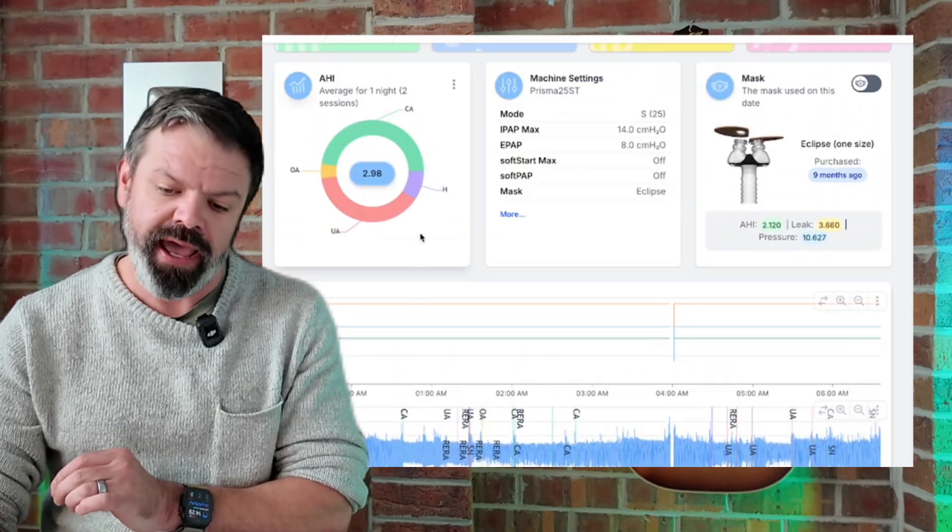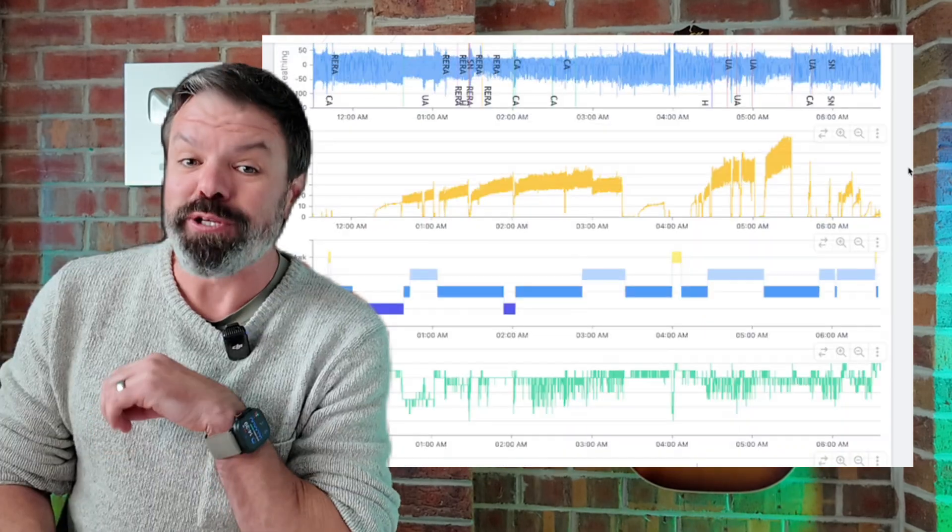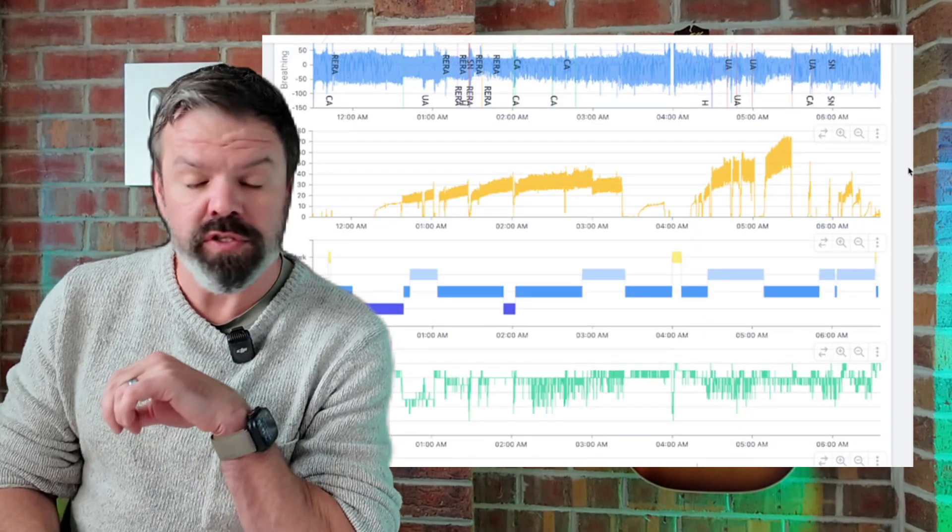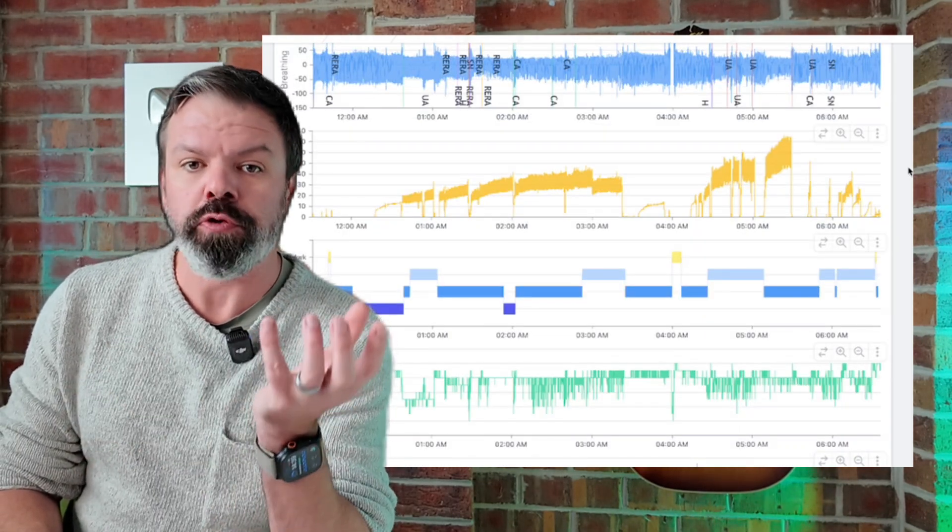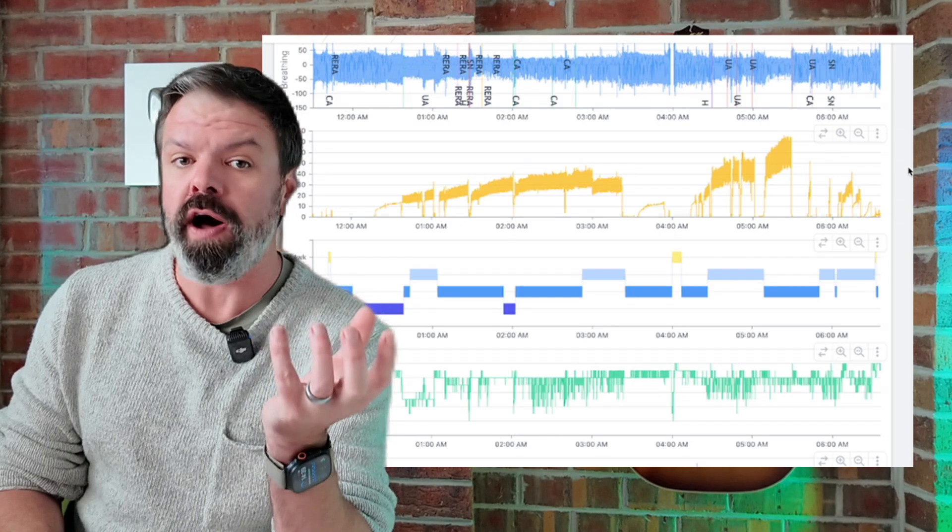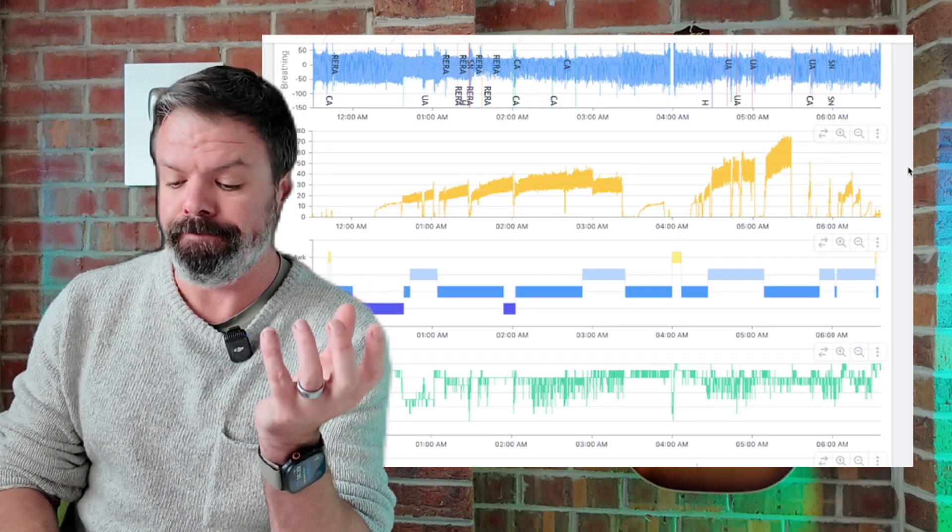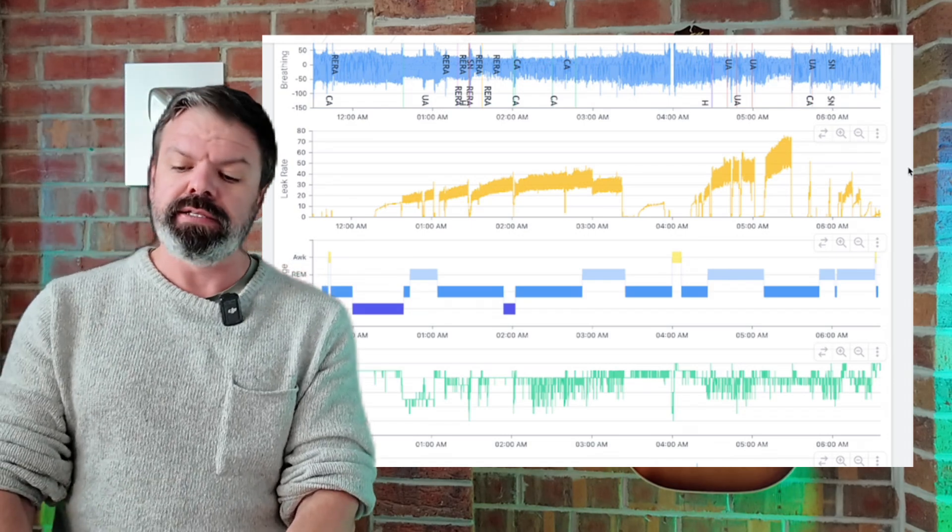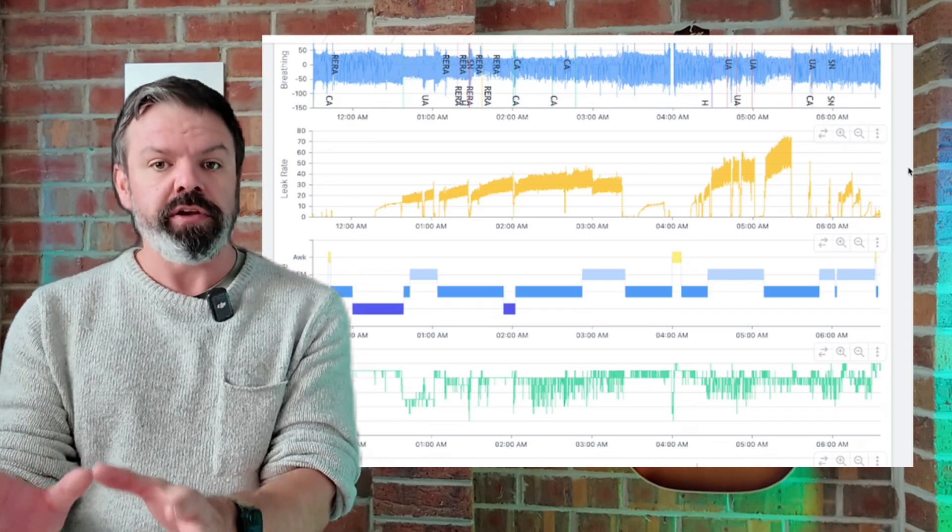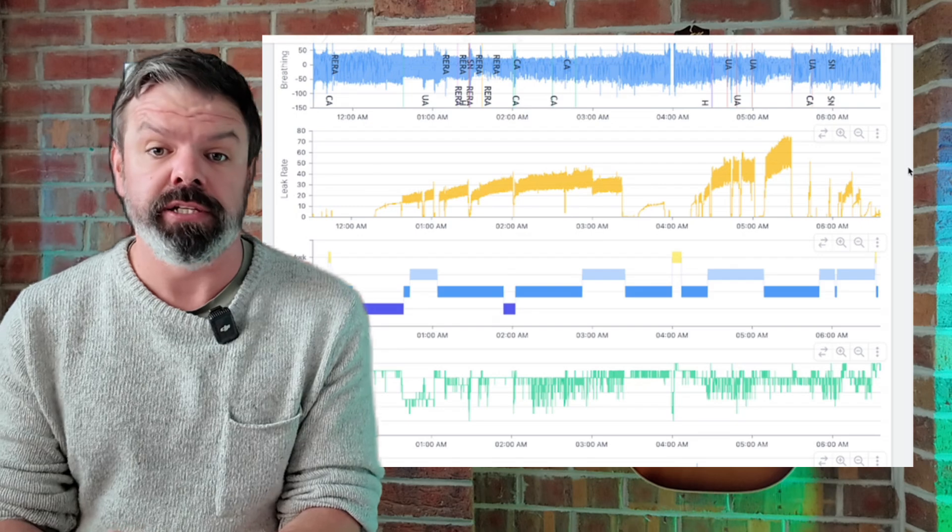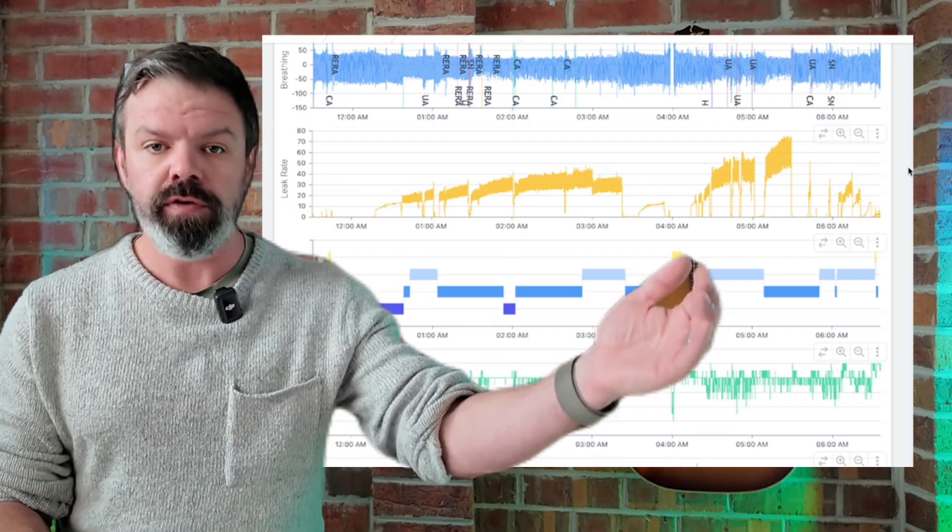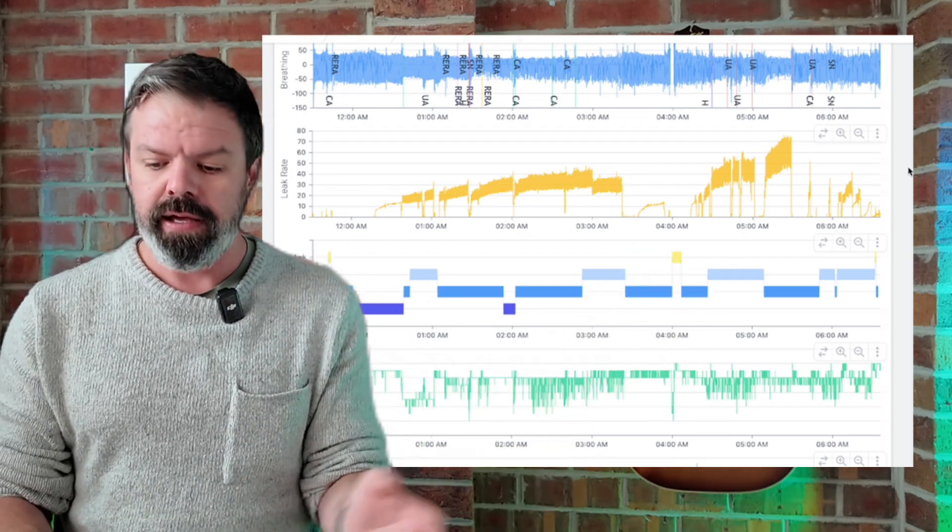And this just shows you why it's so important, because this isn't picked up in the AHI. If we come up to the AHI, look, only 2.98. Now I should also point out that if you have high levels of leak, the water in your humidifier chamber will run dry much faster. And there's another big problem: a lot of this information that I've shown you here today isn't monitored by a clinician. It's not available in AirView. It's not available in MyAir.